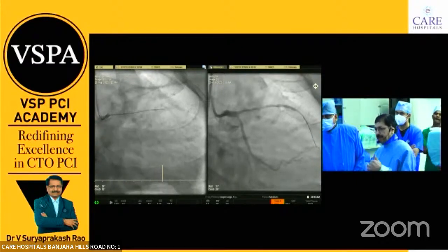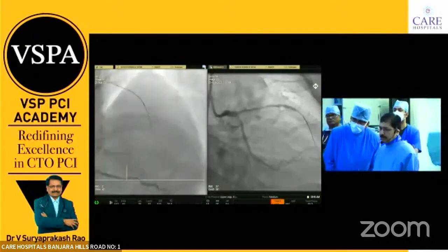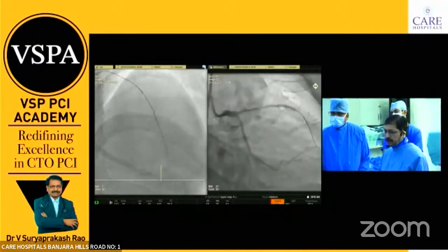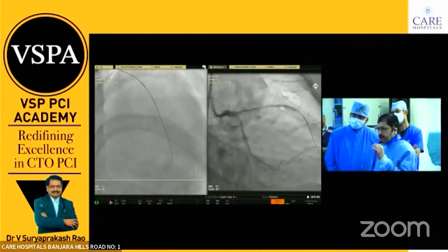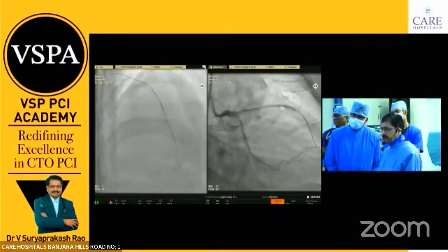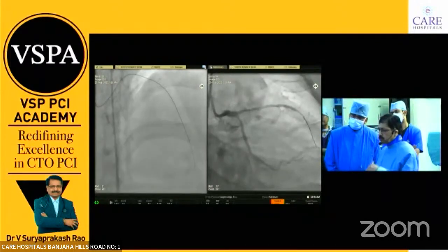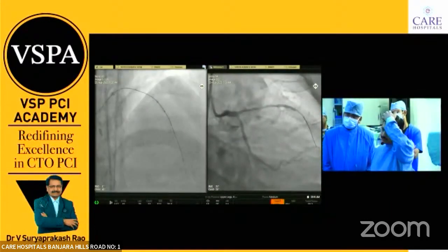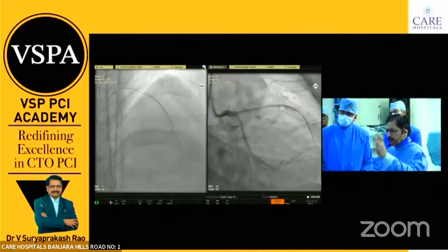Then I came back to the cranial view again. And here, on the cine, I can cross the lesion with the Fielder XT wire. And the Corsair catheter navigation over this wire is not possible because of the calcium and the tight lesion. So we don't try hard in these lesions because the entire system may come out. So better you take a balloon trap technique and take out the Corsair and do a balloon dilatation.